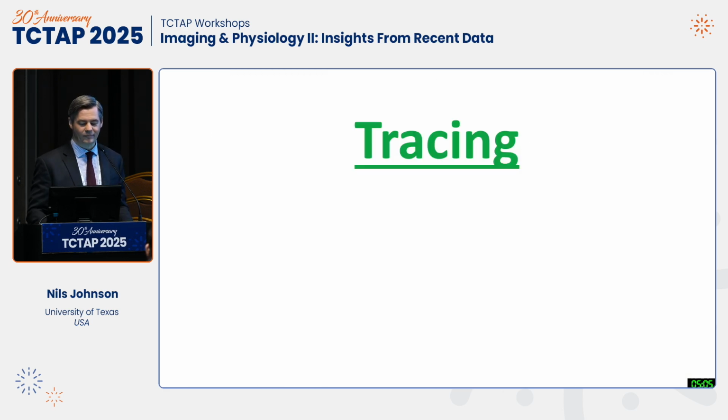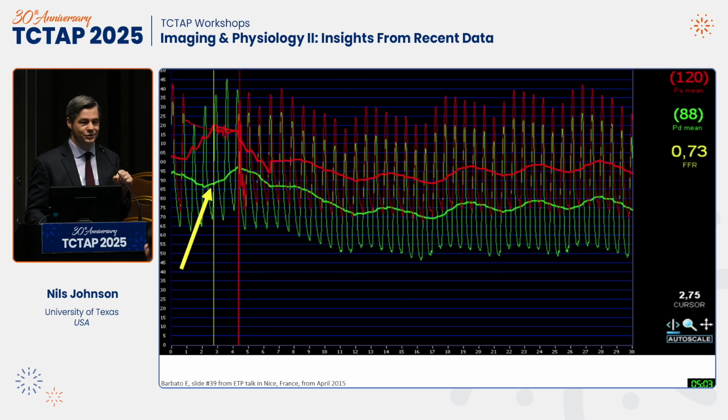I'll just do one last tracing to finish, and then I'll have shown you, I think, kind of the 5 or 6 big artifacts. So last one. Again, red is the guide catheter, green is the coronary artery, the vertical yellow line is where the computer has made the selection for an FFR of 0.73.